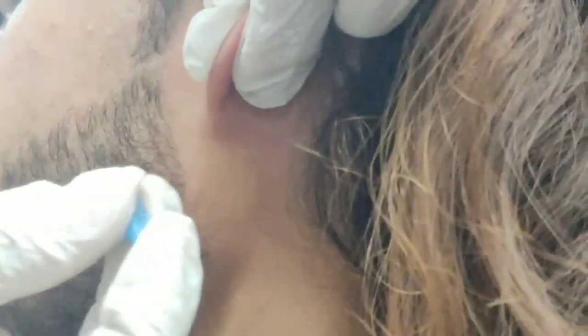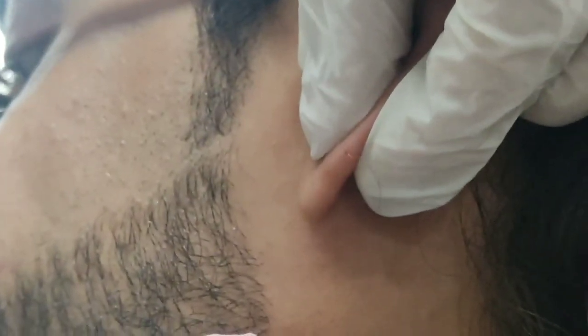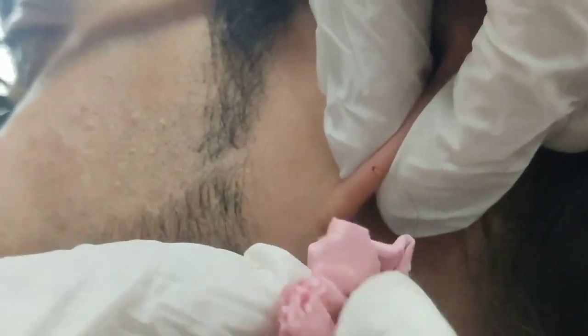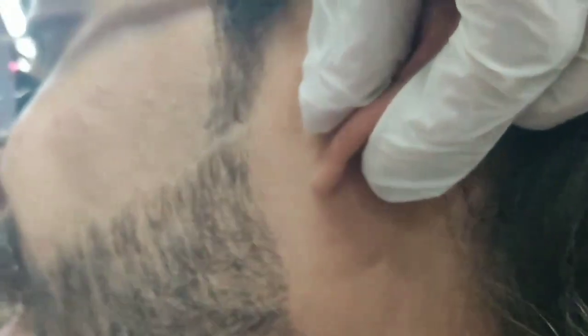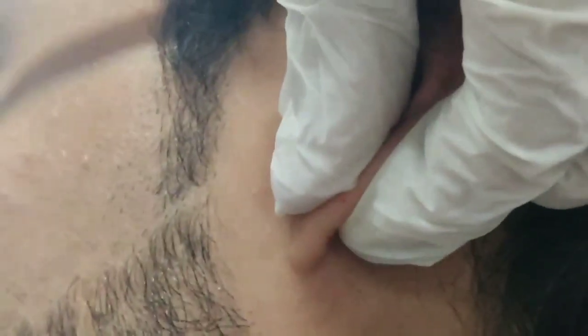Once the area is clean, we make a prick using the lancet. As you can see, a prick has been made and after a short time the blood flow starts. To encourage more blood flow, we apply a little pressure on the area, as you can see.